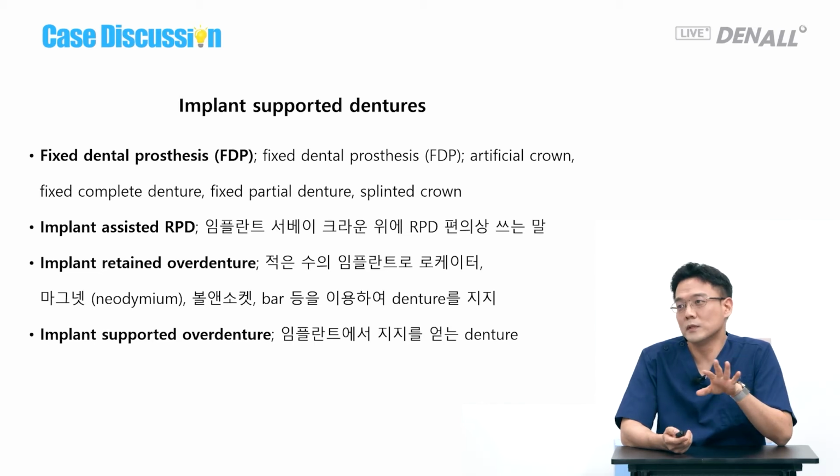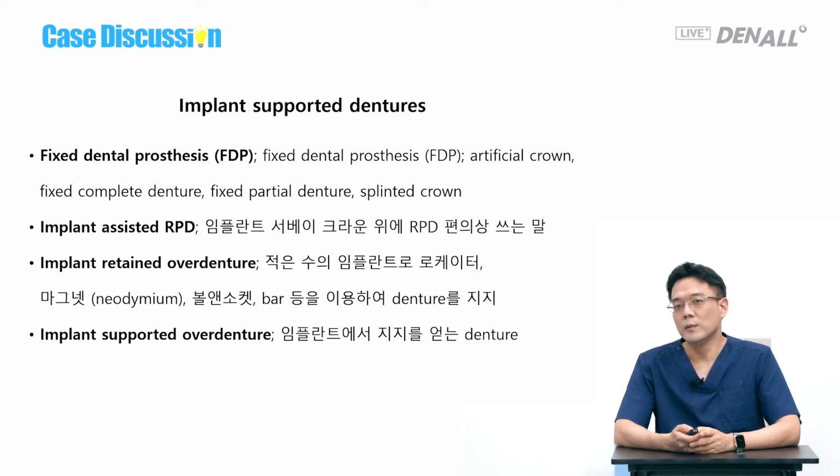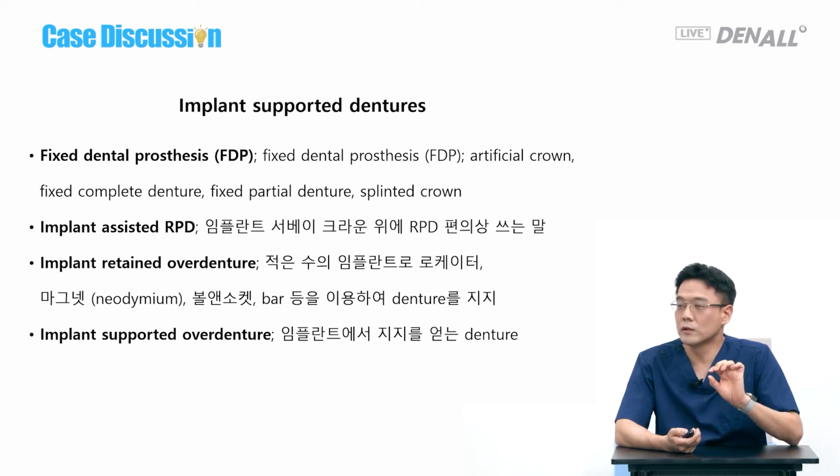She likes the denture, but usually patients cannot think of lip support, so that's the kind of fixed dental prosthesis. Implant-assisted RPD is widely used, so sometimes it is called implant-assist or implant-assisted RPD. Implant-retained overdenture. This is using a small number of implants. Implant-supported overdenture. These are commonly used terms.